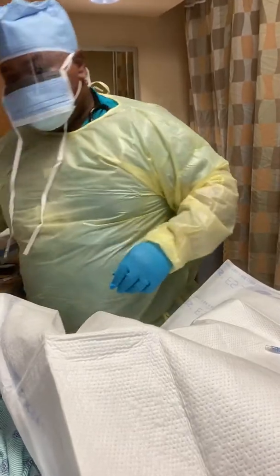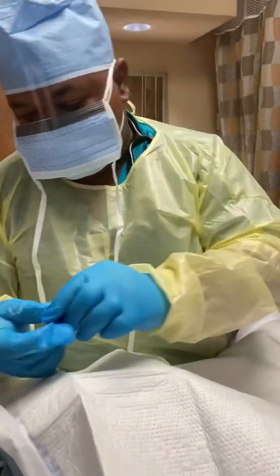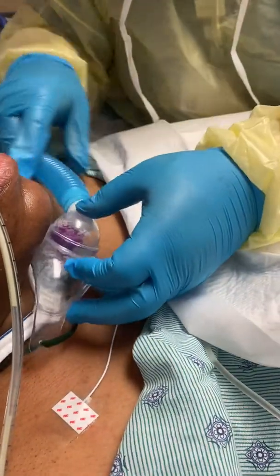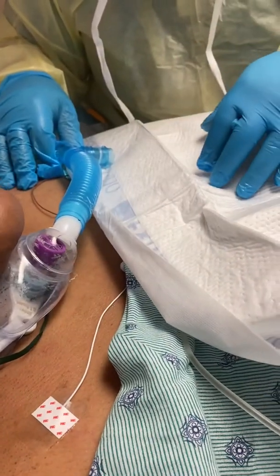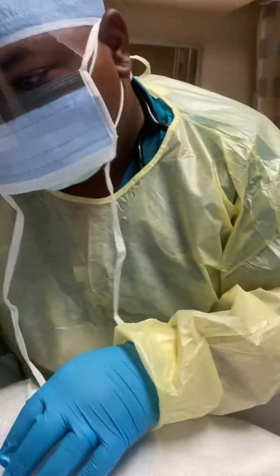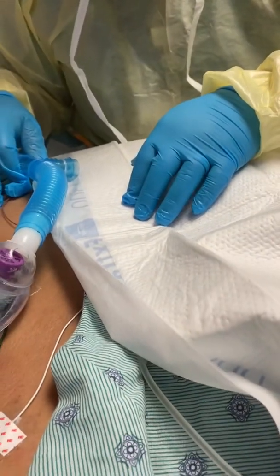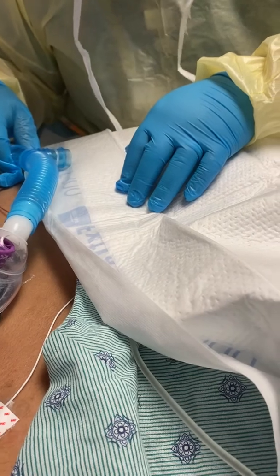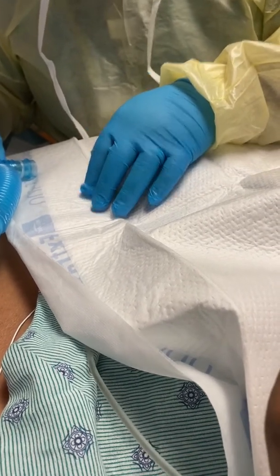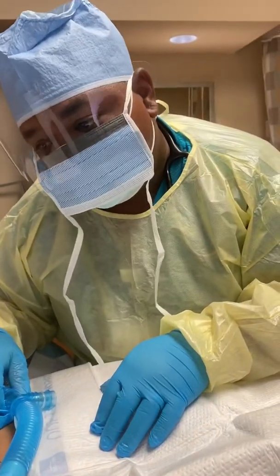Let's see — speaking valve here, Passy Muir valve. What's your name? Just say one, two, three, four. One, two, three, four. Much better! Does it feel better? Yeah. So you're going to keep working on getting your voice strong. We can hear you much better than before.